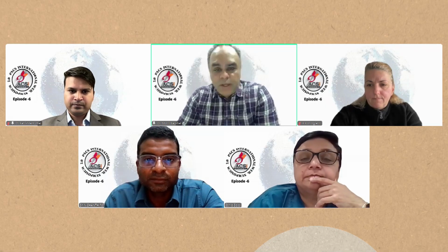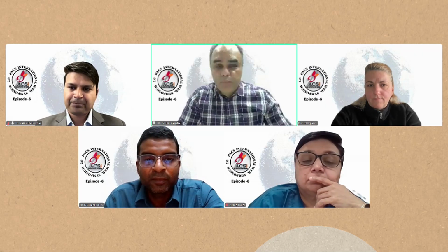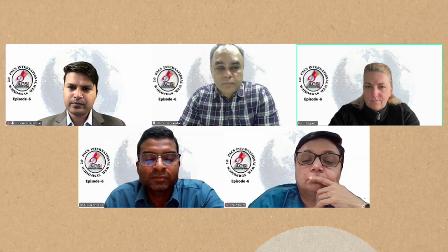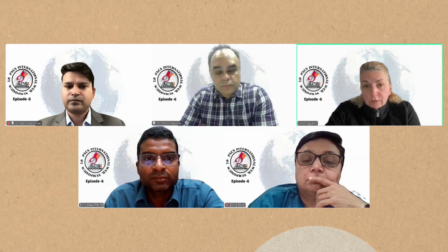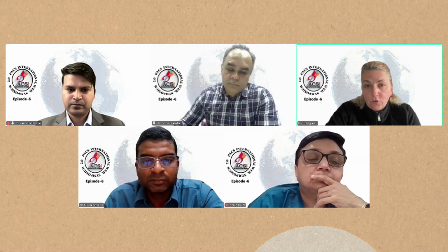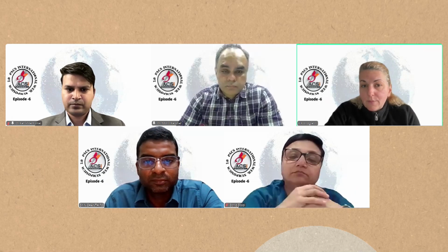Professor Konstantina, what will be your take here? Somebody or a patient gets a pneumothorax on the table. Take it out, and if you have fluoroscopy in the room, check the lungs to make sure, and auscultate the patient, of course, and then try to support.